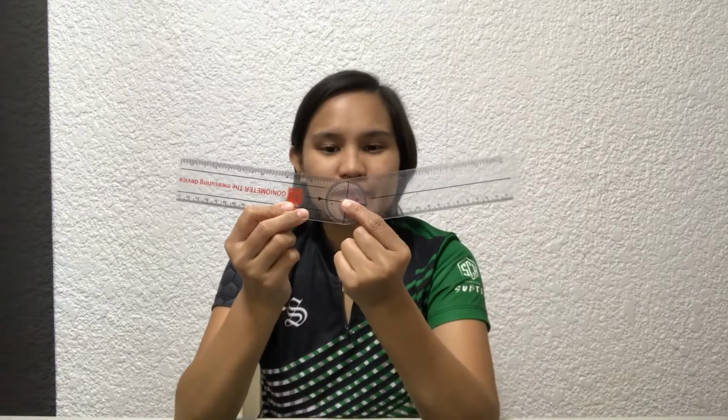Before we get into the measurement itself, it is important for you to know that this is where our background knowledge in anatomy is very important, because before you perform the range of motion assessment, you have to identify the specific bony landmarks where you can place the fulcrum or the middle part of the goniometer, and where you could align the stationary arm or the moving arm of the goniometer so that you will be able to identify the specific points for measurement of the angle. Alright? So, now let's try to demonstrate.